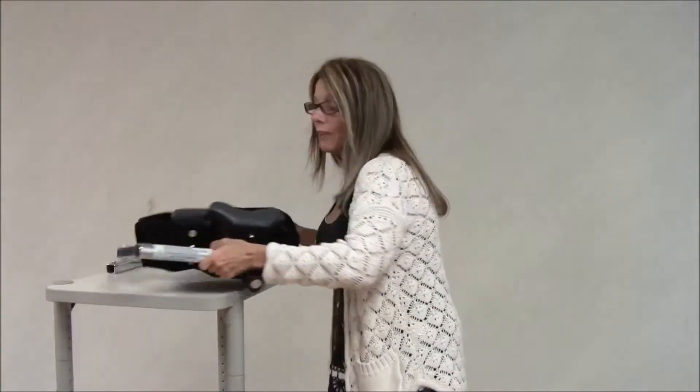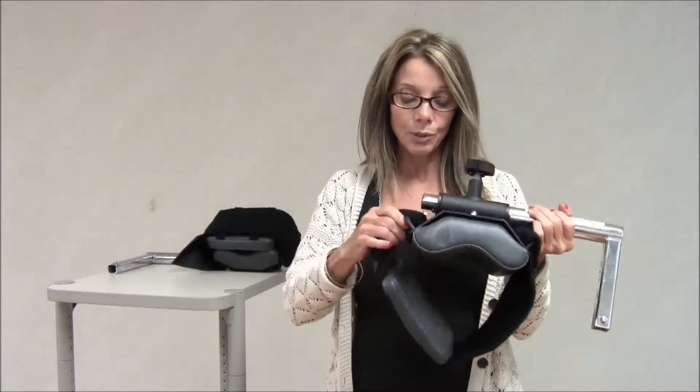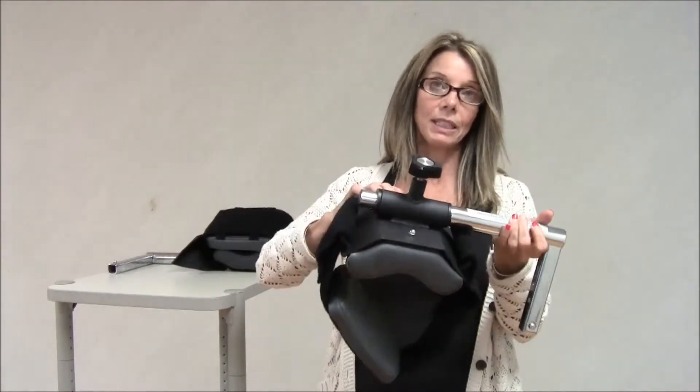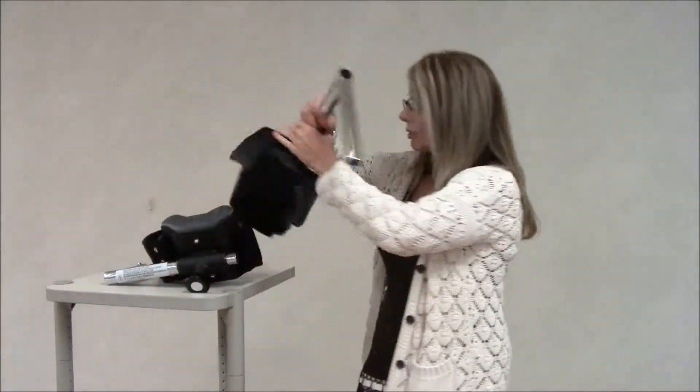Another determining factor that will help you identify the pediatric attachment is the supports for the Velcro straps. On the pediatric attachment, they are on an angle, as you can see. And on the adult attachment, they are just on a vertical.